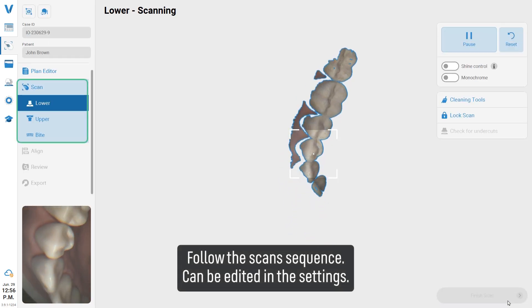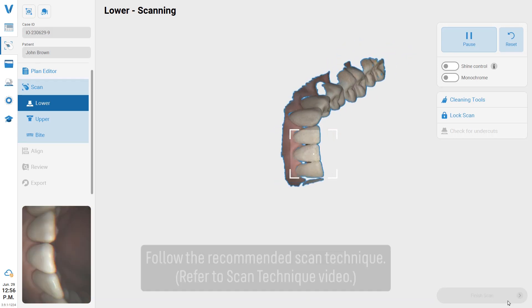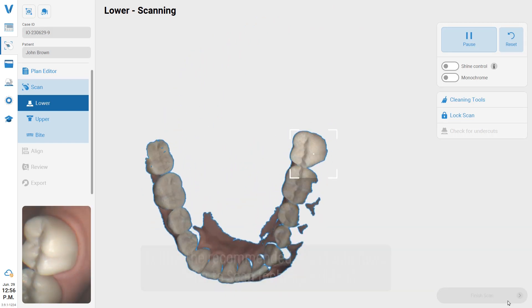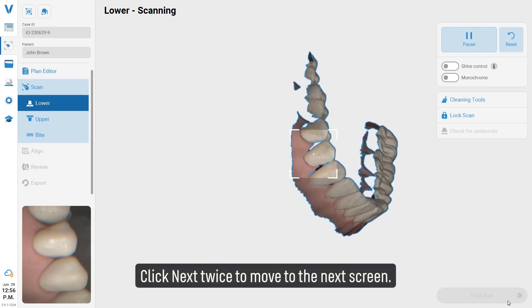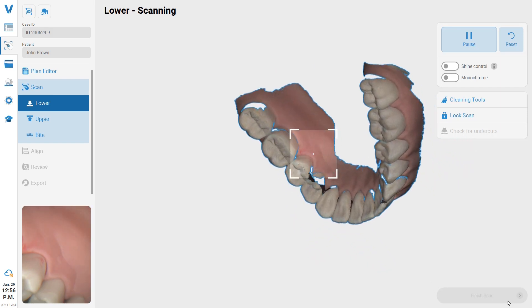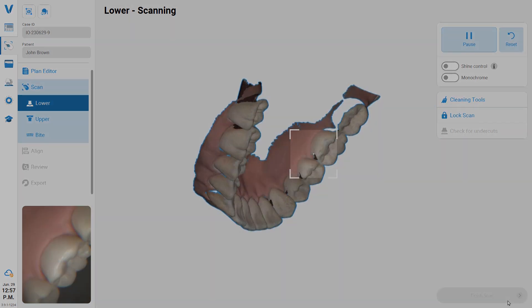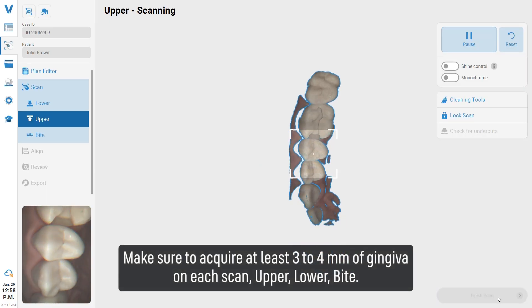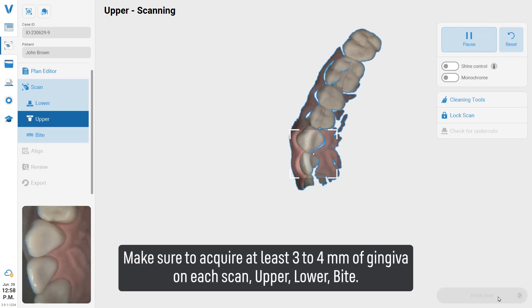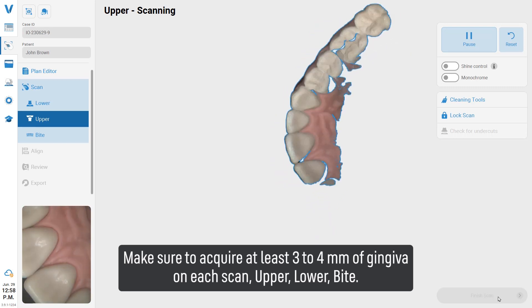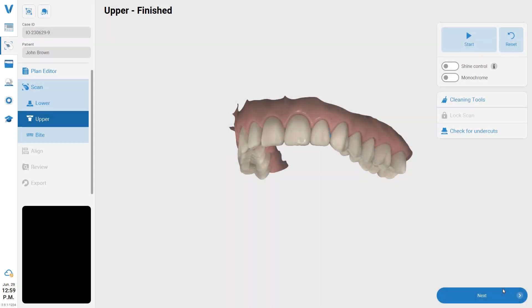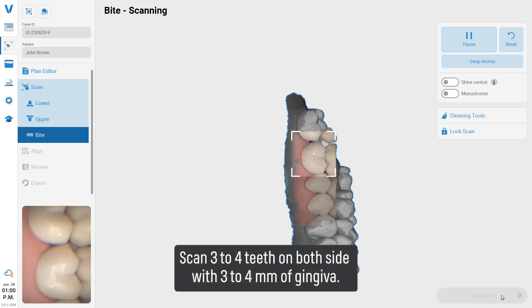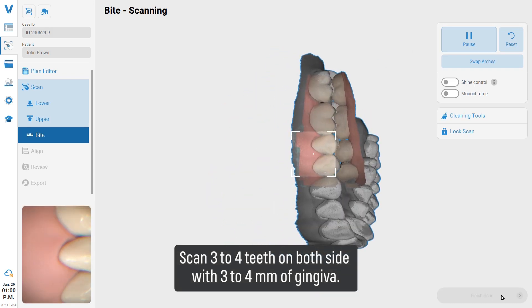Follow the scan sequence, which can be edited in the settings. Follow the recommended scan technique — refer to the scan technique video. Click Next twice to move to the next screen. Make sure to acquire at least three to four millimeters of gingiva on each scan: upper, lower, and bite. Scan three to four teeth on both sides with three to four millimeters of gingiva.